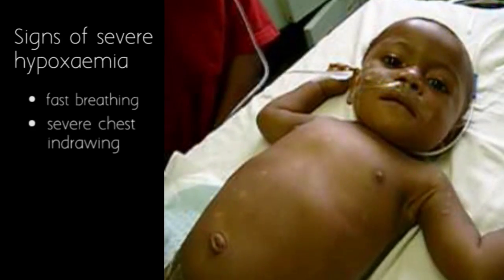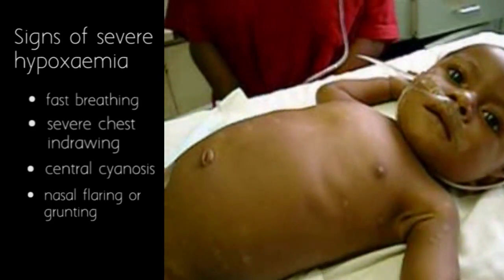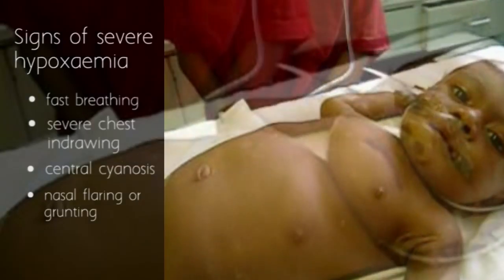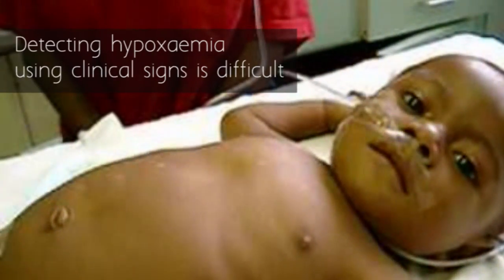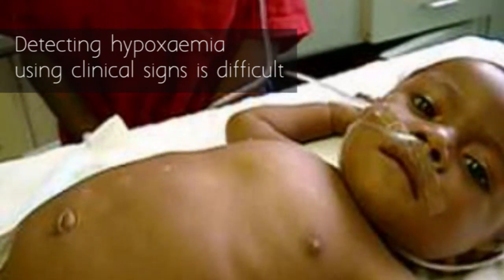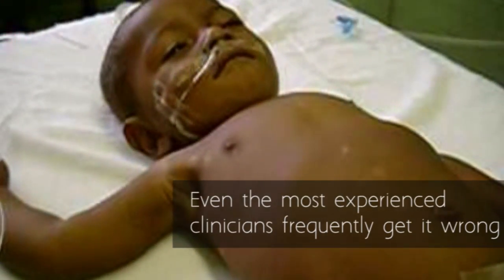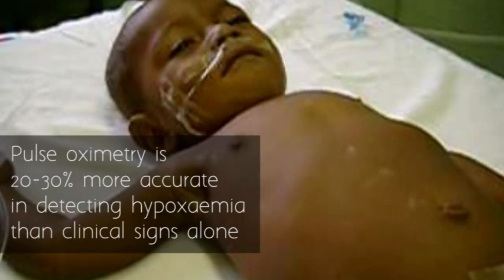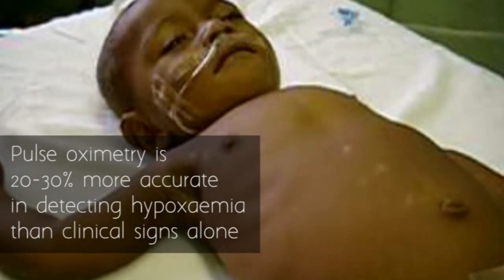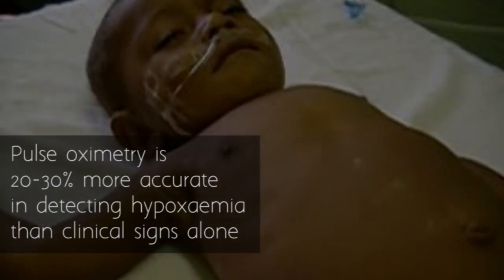Severe hypoxemia may be recognised by certain signs, like fast breathing, severe chest in-drawing, central cyanosis, and nasal flaring or grunting with every breath. However, detecting hypoxemia using clinical signs is difficult, and studies have shown that even the most experienced clinicians frequently get it wrong. Using pulse oximetry can correctly identify 20–30% more children with hypoxemia than using clinical signs alone.